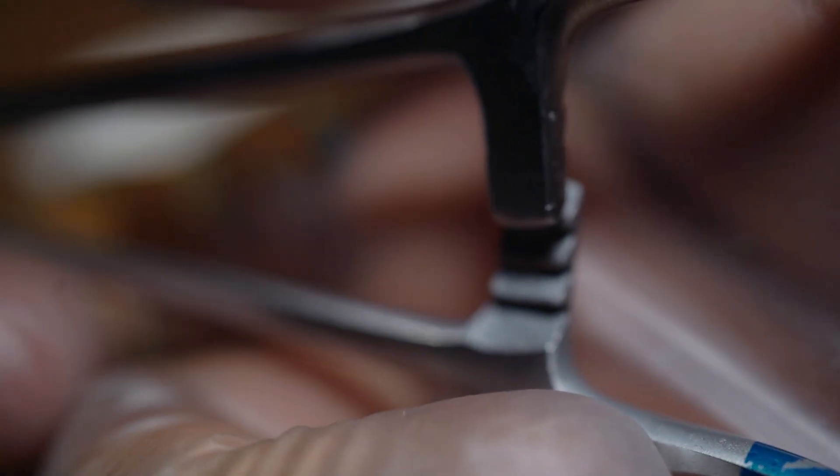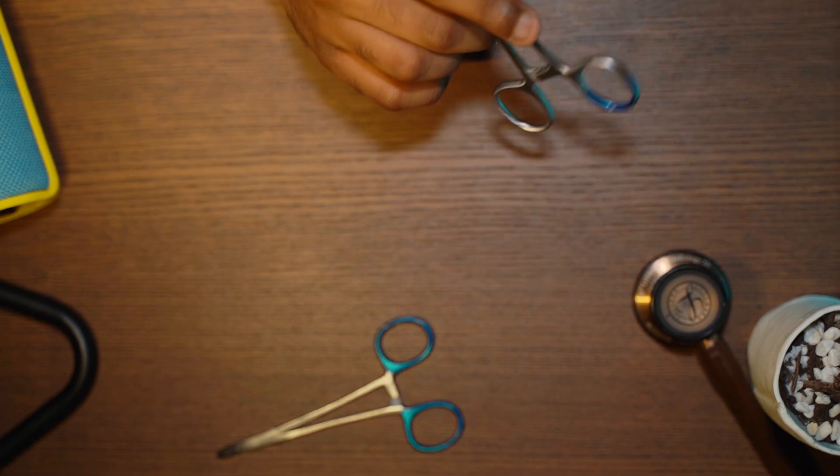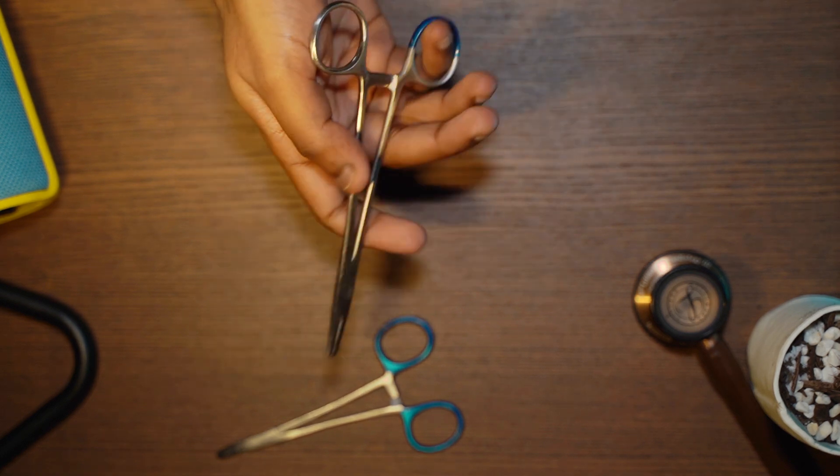Let's see that up close. A lot of general surgeons use this technique to close layers of the abdomen. It's also useful in the ED for suturing thick skin like lacerations to the scalp.